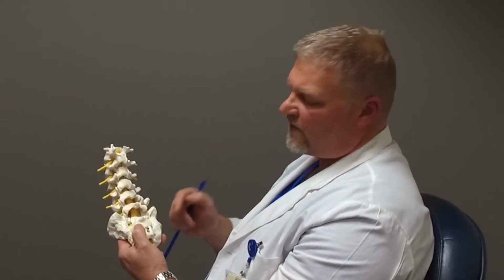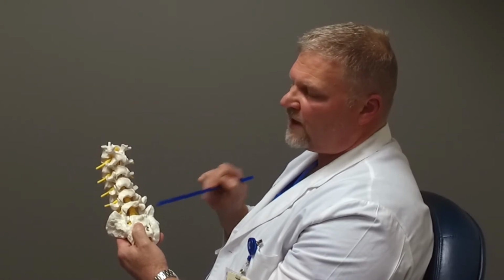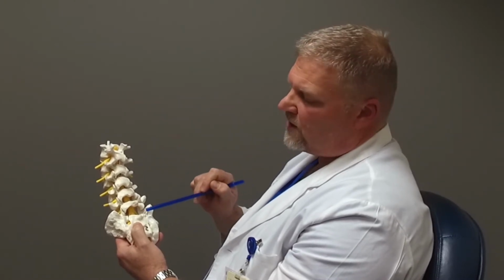The main benefit for interlaminar endoscopic discectomy is we don't remove all the muscle off the back of the spine, we don't drill the bone in the lamina, and we don't violate the joint. When you cut into the joint, you destabilize the spine, and it's more likely to result in instability and need a fusion in the future.